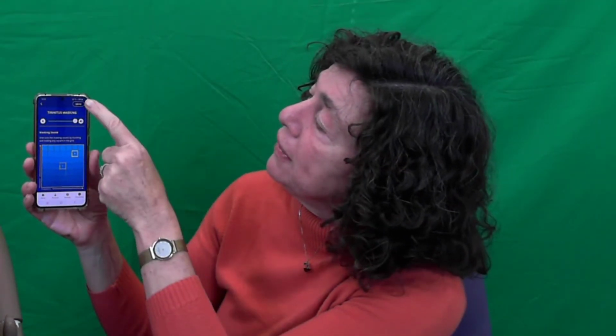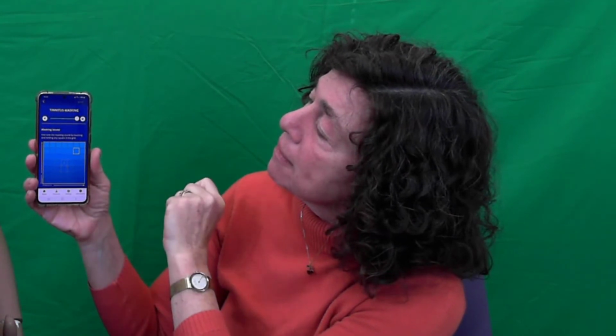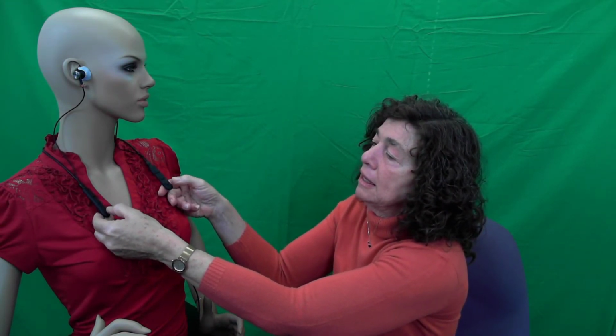To change the frequency and pitch of the sound, you simply place your finger on one of the squares and listen to the sound, and then experiment. Do you hear the difference in those sounds? When you reach a sound that matches your tinnitus, you can then save that, and the next time that you activate the tinnitus masking, it will use that customized sound.